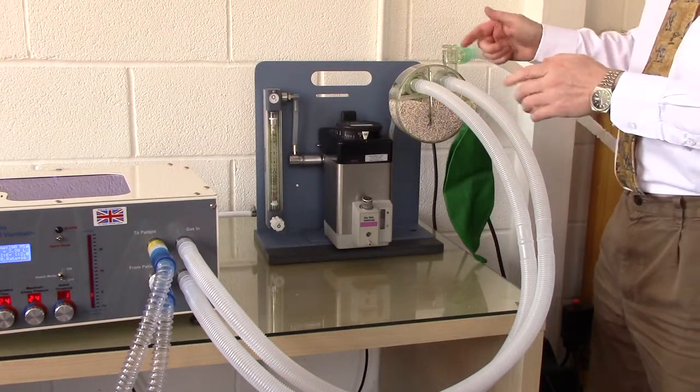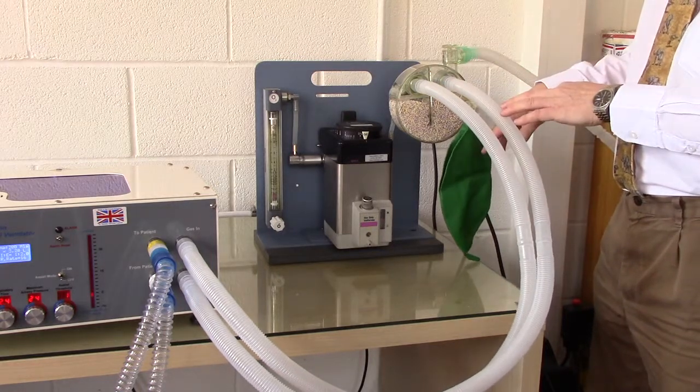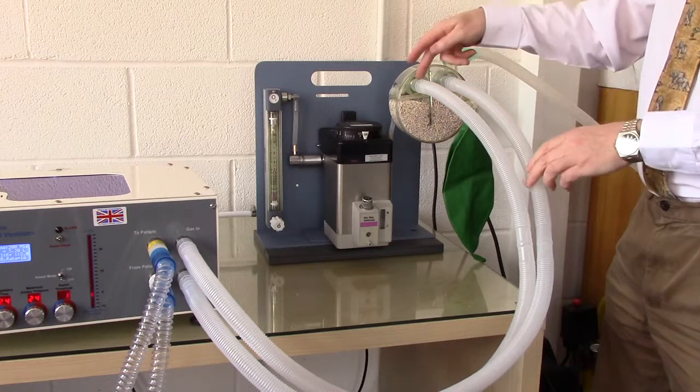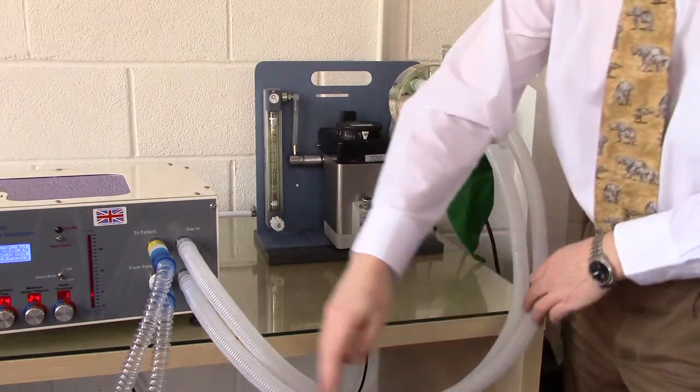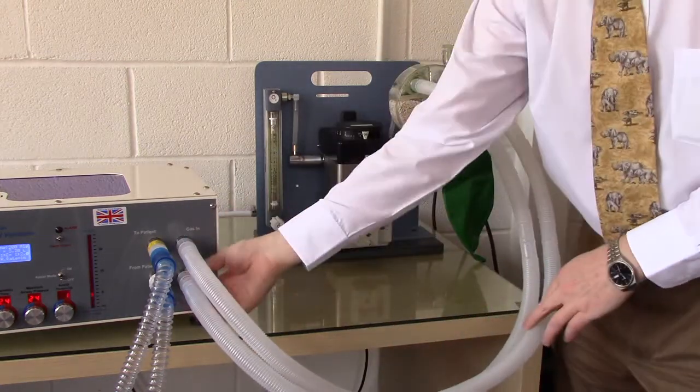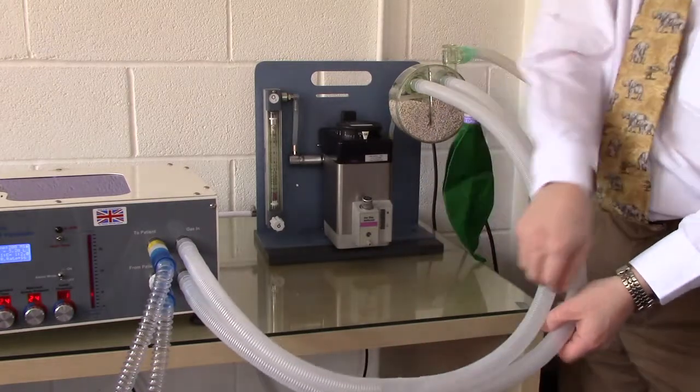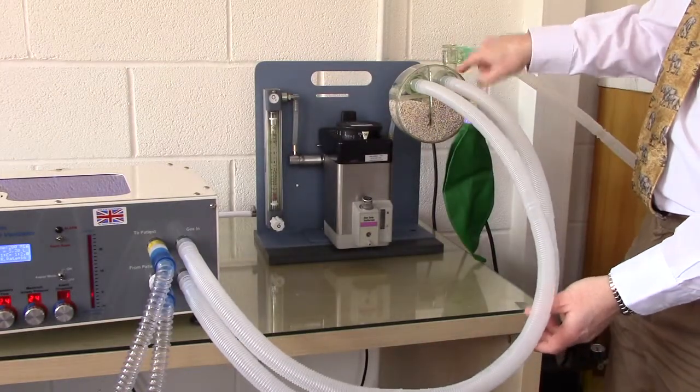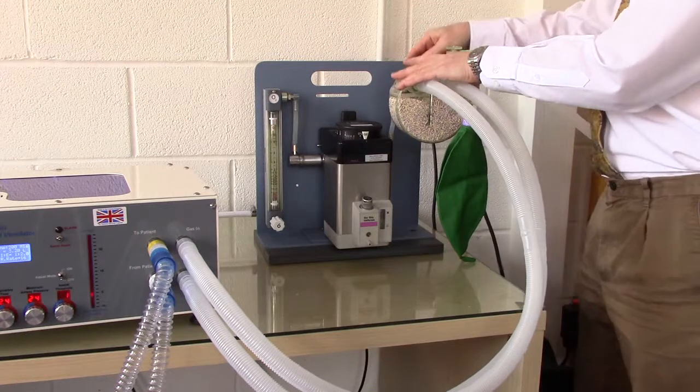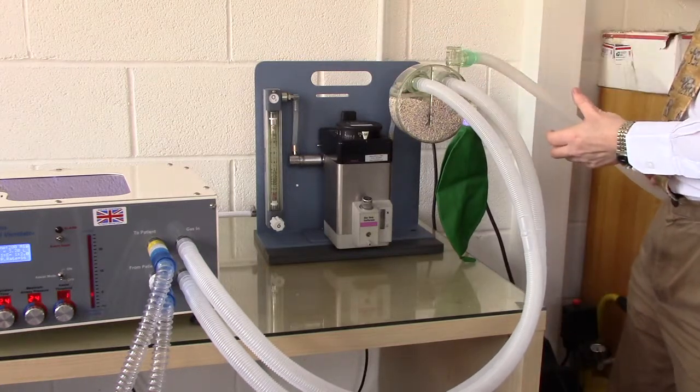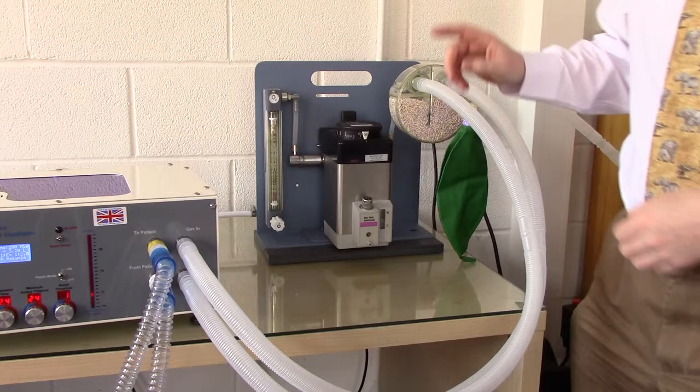In this configuration there must be a reservoir bag on the inspiratory limb to take up incoming gases. Gas from the inspiratory port of the circle passes down to the gas in port of Merlin, and gas from the gas out port of Merlin passes back up to the expiratory port of the circle. Then excess gas is voided through the spill valve out into the waste gas circuit.